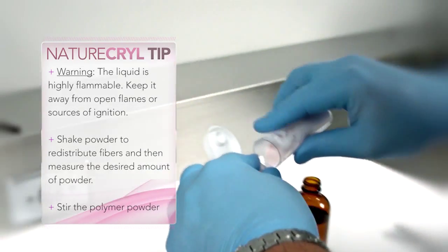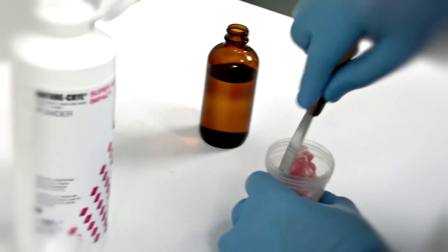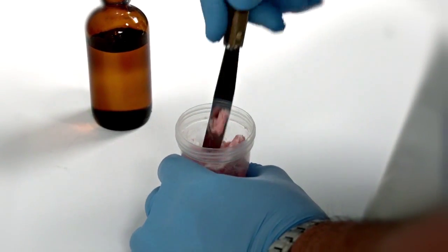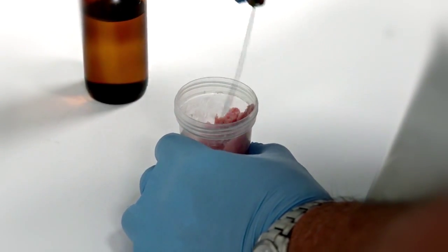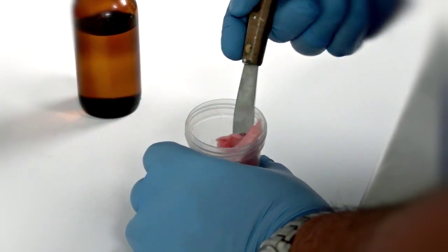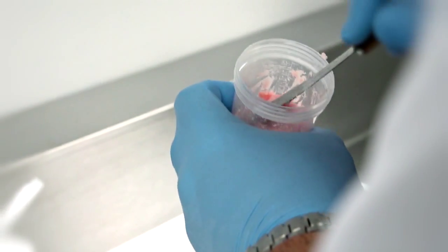Ooh, right on. That's 2. Now, this material will have a little bit of a drier mix, so don't get worried. The last thing we want to do is end up putting in more monomer. You'll see that as you start mixing it, the dry mix becomes moist. That's just the nature of this material as a high impact material. As you can see now, the dry mix is becoming moist.